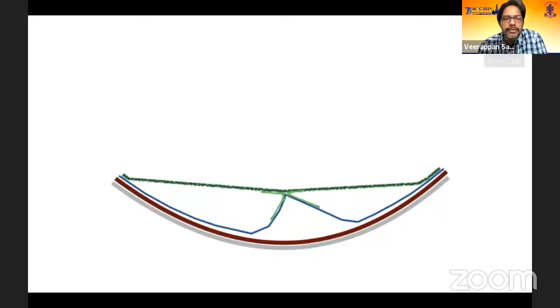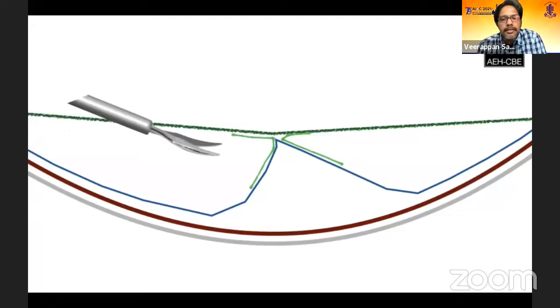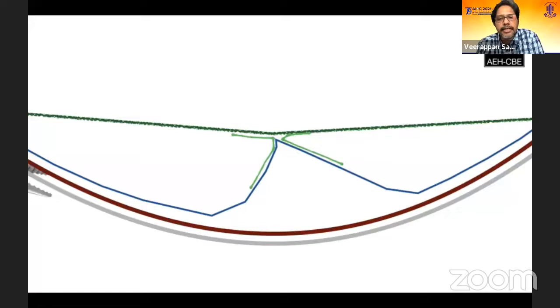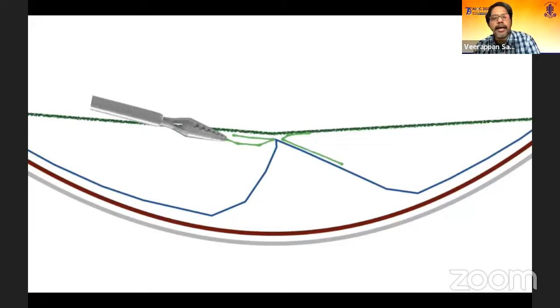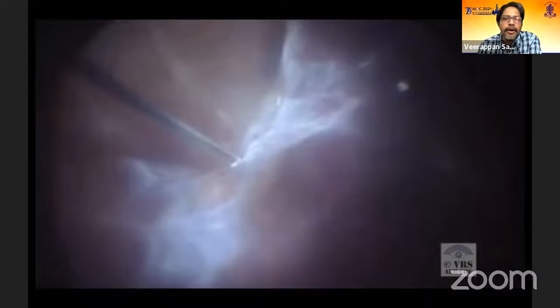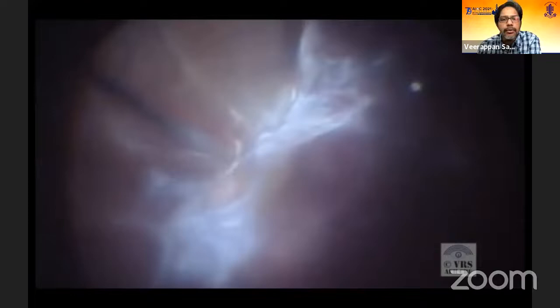This video shows the importance of the second membrane. You can see the PVD and the second membrane running across the surface of the retina onto the PVD. Working in the sub-hyaloid plane is not the right plane and leads to many complications. Always identify the second membrane, lift it up, and work in the sub-second membrane plane — this is your ideal surgical plane. This converts so-called broad adhesions into multiple point adhesions, making them much easier to address. In this case with a loose adhesion, just the cutter itself is enough to elevate the second membrane and enter the surgical plane. What looked like a large tabletop broad adhesion becomes multiple point adhesions, and I can use cutter delamination with low suction and short bursts of cutting to address the membrane.